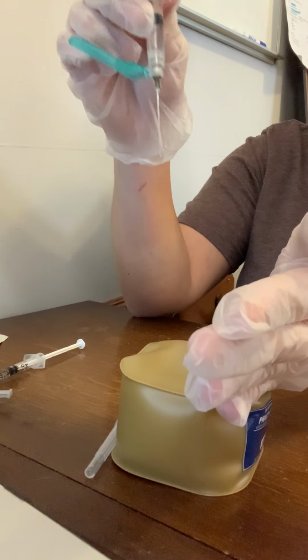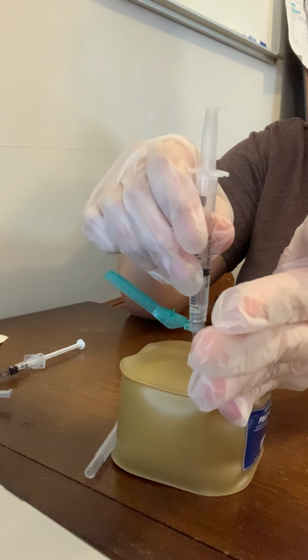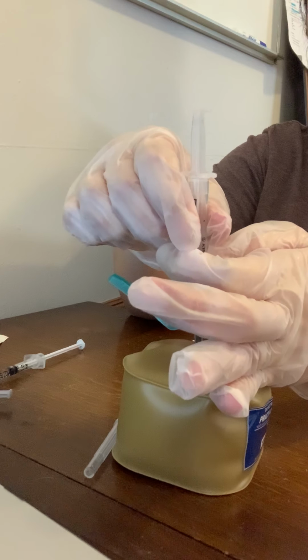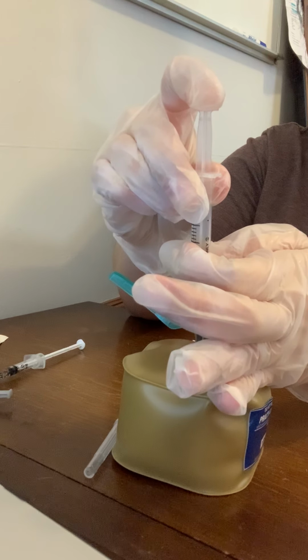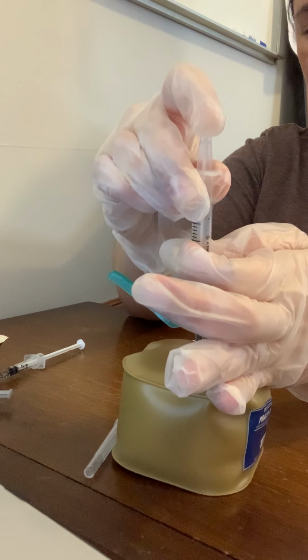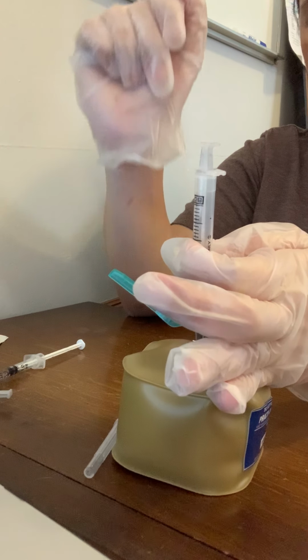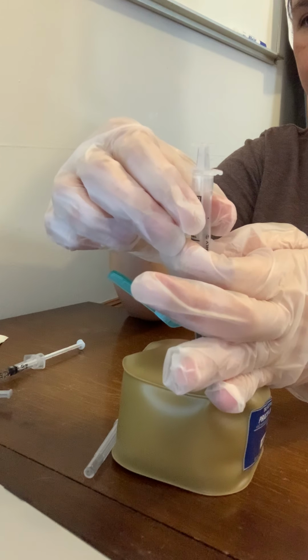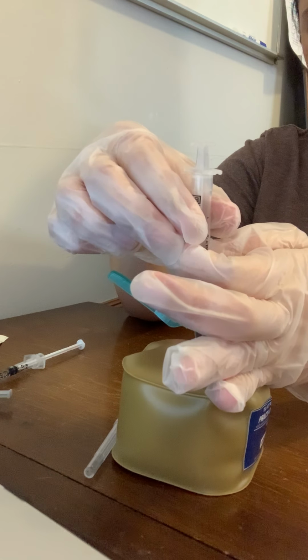I'm going to inject at a 90-degree angle, stabilize with my other hand, and slowly inject the medication. And I'll leave it here for about 5 seconds to make sure that the medication is administered.